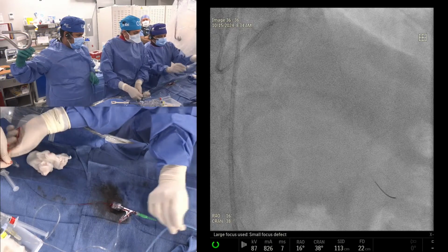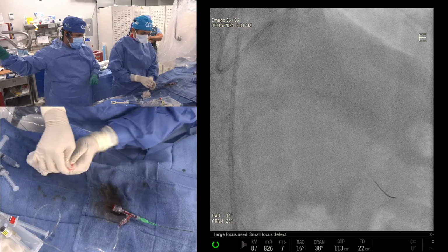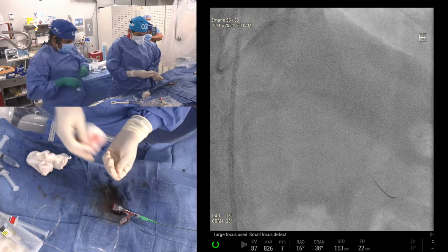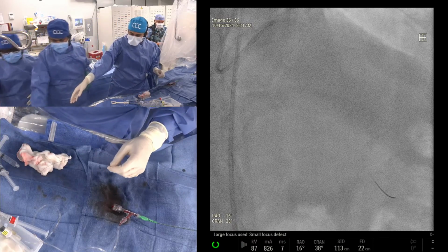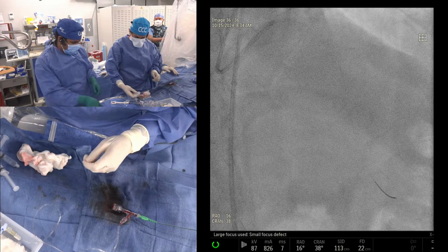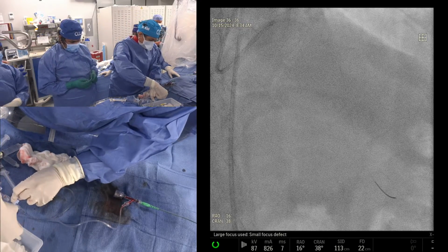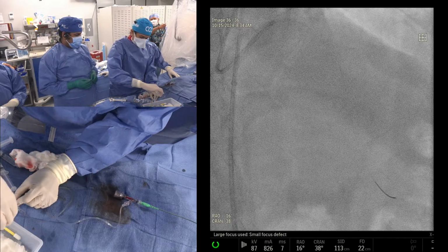Excellent crossing time. This is Dr. Mahmood El Rais, who joins us almost every time. Yes, he is always on the live case. Okay, let's give a little medicine, rehabilitate the vessel, and let it dilate a little bit. Let's IVUS now, no picture, but give some medicine to get the real vessel. The artery was sleeping until now, just woke up. Nitroglycerin, verapamil, all the good stuff, I call them. Epicardial vessels.